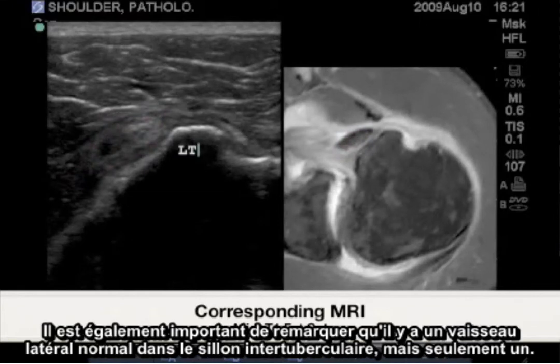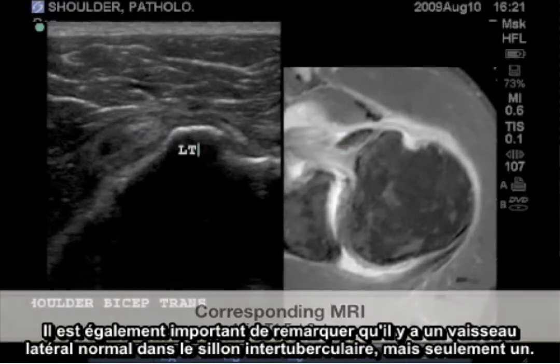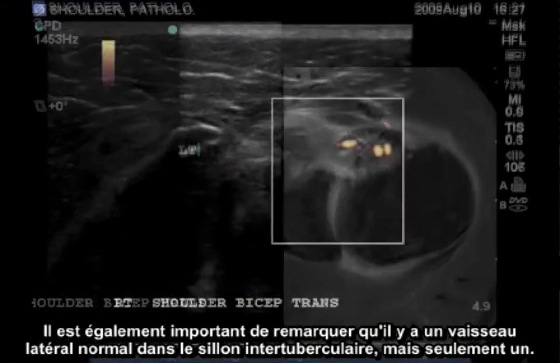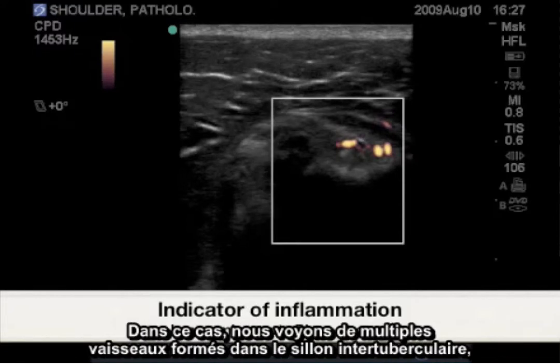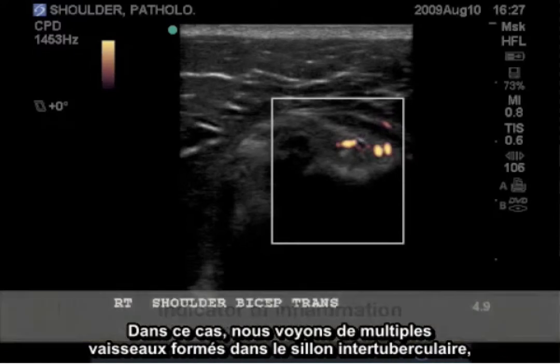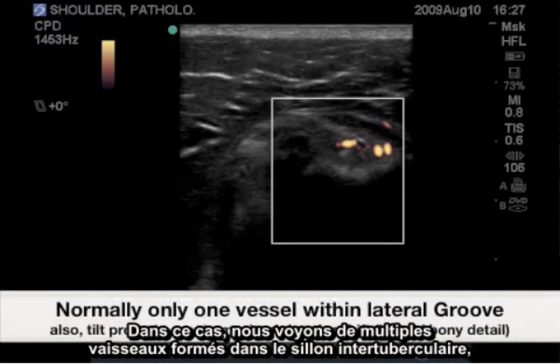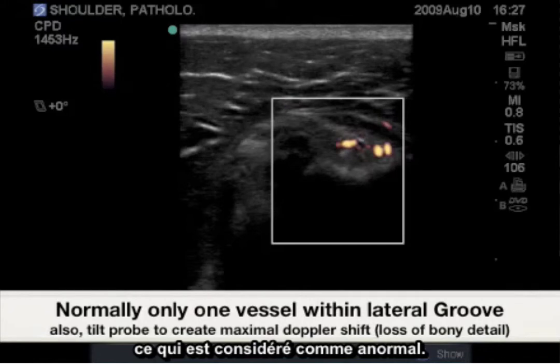It's also important to note that there is a normal lateral vessel to the bicep groove, but only one. In this case, we see multiple vessels formed throughout the bicipital groove, which is considered abnormal.